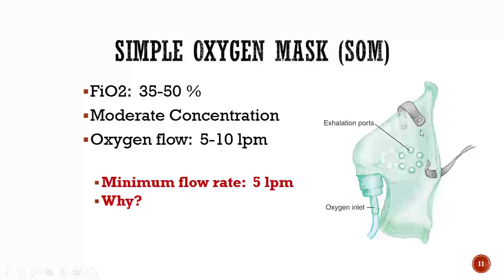And then you create a scenario where they're rebreathing their own CO2. And that is not something that we want. This is something that you commonly see because people will come in with simple oxygen masks from other facilities. And I have seen them set below 5 pretty consistently because they'll look at a patient that's saturating well and they'll just turn down the liter flow. It's very, very dangerous. These can never be used at less than 5.